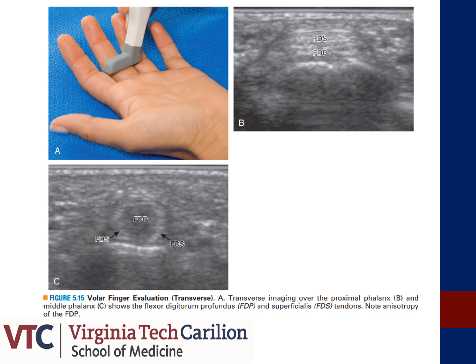Figure B is taken at the level of the proximal phalanx, where your superficialis tendon remains superficial, while figure C is taken at the middle phalanx and demonstrates the split in your FDS tendons as it goes to attach on your middle phalanx, and there is continuation of your FDP tendon, which is now superficial to your FDS.